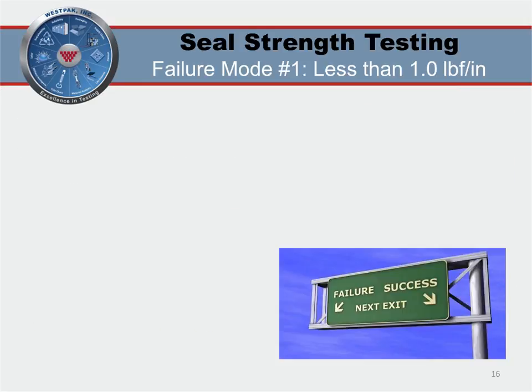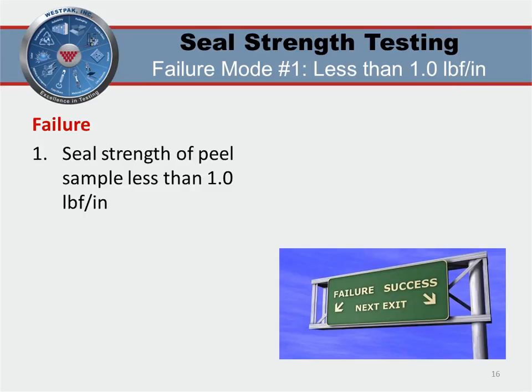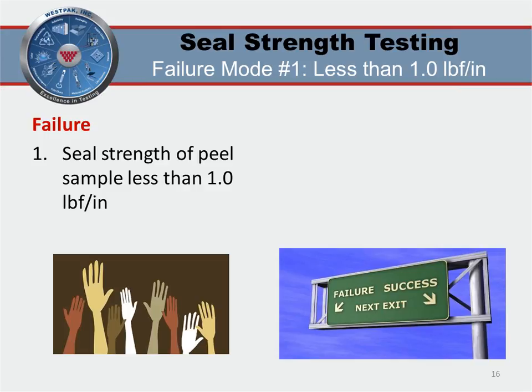Our first failure mode for peel strength testing is seal strength less than 1 pound force per inch. Can everyone give us a quick show of hands for how many of you have had this issue? I'll give you guys a few moments to answer.